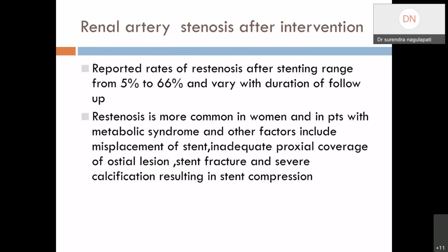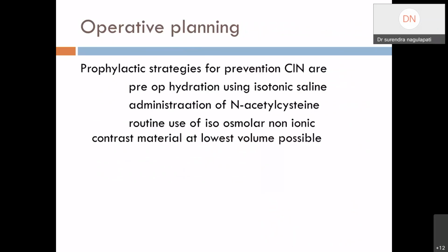Coming to the technique used for endovascular stenting, we should know that on the renal ostia in the anterior-posterior view, there is poor opacification of the origin. So we need to use oblique imaging, which corrects the artifact resulting from the contrast overlap between the aorta and the proximal renal artery. Multiple renal arteries are present in 18% of cases. We should remember that before going for the procedure.